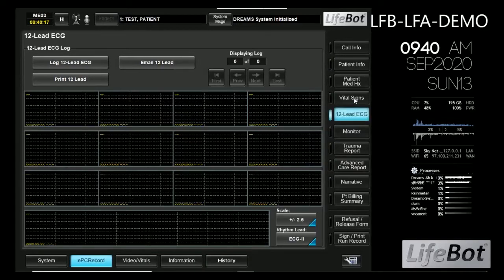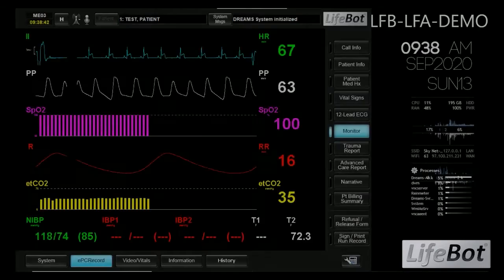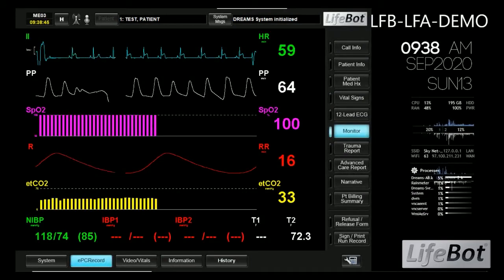If we had connected an ECG, we could also see those biosignatures in the interface. Other standard peripherals like end-tidal CO2 sensor and ultrasound are also available.